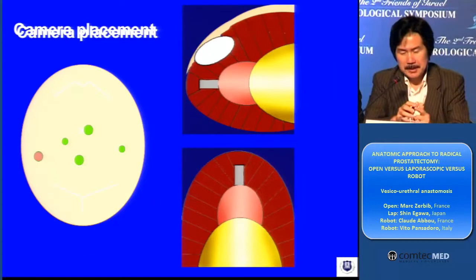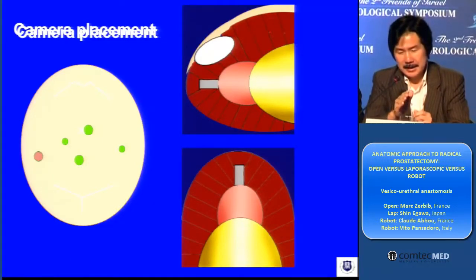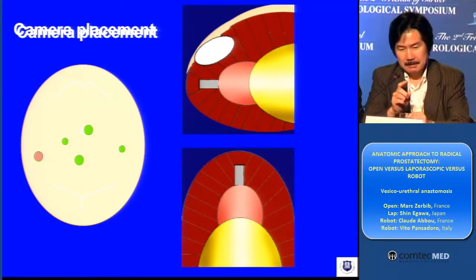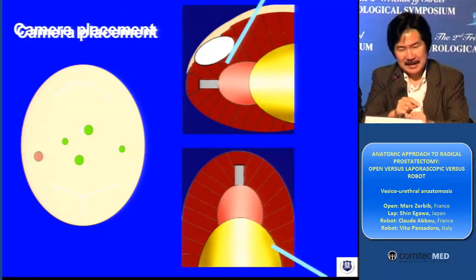When we do laparoscopic surgery, I usually use a right lower port of the abdomen as a camera port — a camera placement port. So this is the camera placement I usually use.